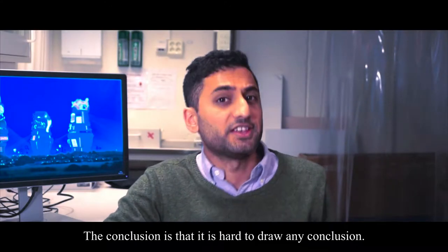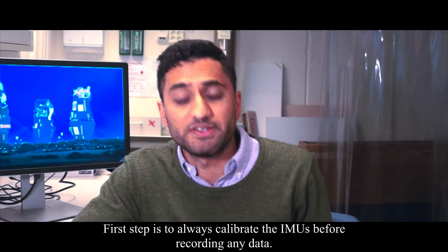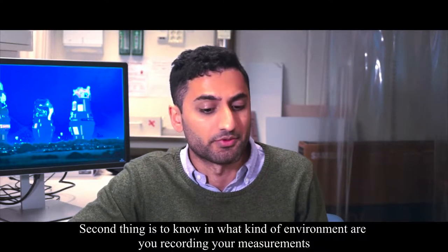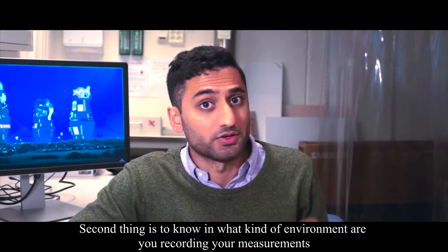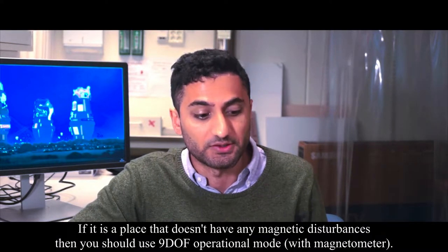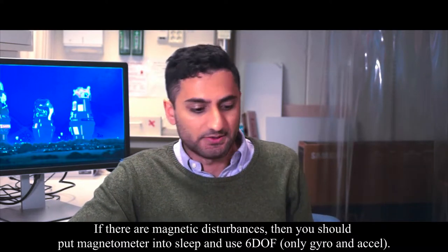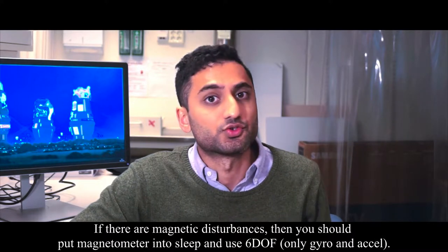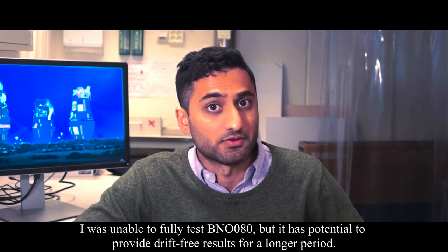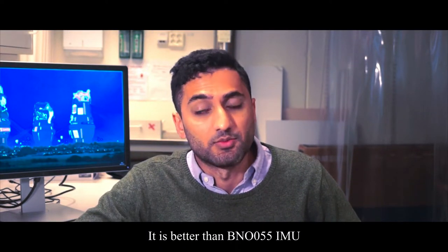So what is my conclusion — can IMUs be used for longer measurements of knee joint angle? The conclusion is that it's hard to draw any conclusion. Step one is to always calibrate them before doing the measurements. The second thing is to consider your environment: if it doesn't have any magnetic disturbances, go for the 9-degrees-of-freedom mode with magnetometer. If there are a lot of magnetic disturbances, try 6-degrees-of-freedom mode using gyroscope and accelerometer only.